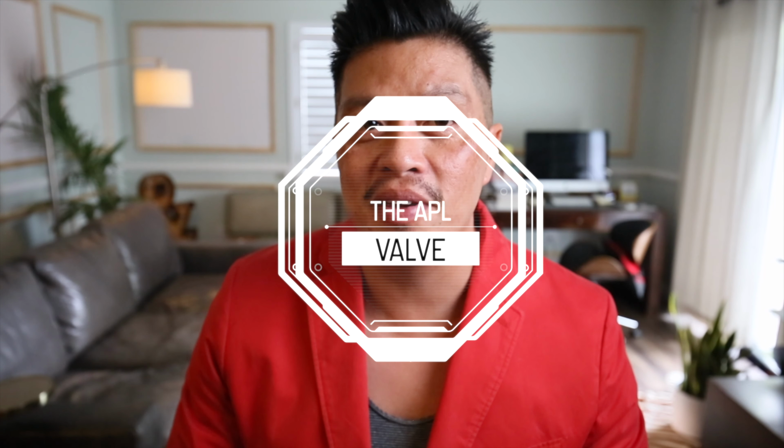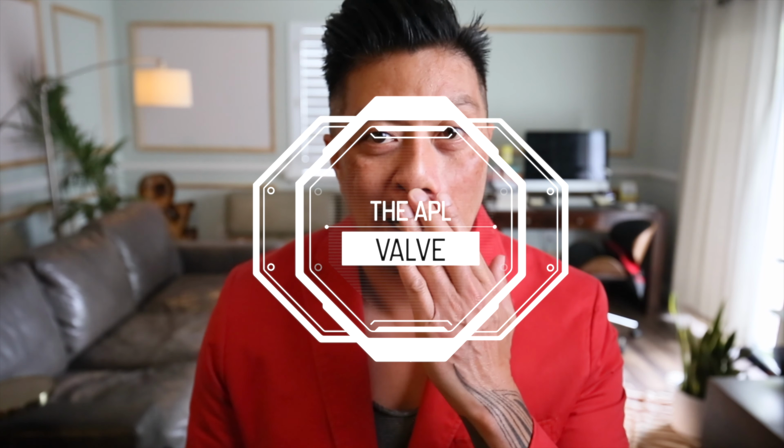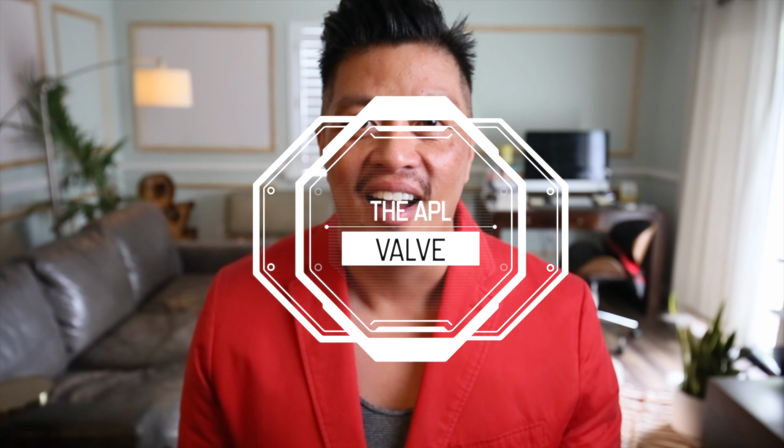All right, now we're going to talk about the APL valve, and this little valve contraption has confused me to no end. Just looking up on Wikipedia, the adjustable pressure limiting valve is commonly abbreviated to APL, and also referred to as an expiratory valve, relief valve, or spill valve. It is a type of flow control valve used in anesthesiology as part of a breathing system. It allows excess fresh gas flow and exhaled gases to leave the system while preventing ambient air from entering.